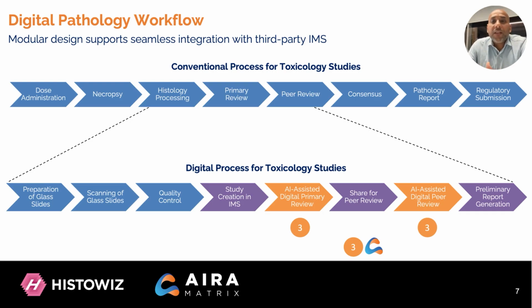As we transition into digital workflows, ensuring the quality of histopathology images becomes paramount. Artifacts such as out of focus regions, missing tissue, stain inconsistency, and air bubbles can impact the accuracy of diagnosis and reporting. A robust quality control mechanism is essential to detect and quantify these issues, ensuring that only high quality images are used for analysis and reporting.